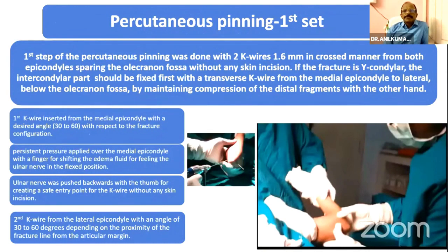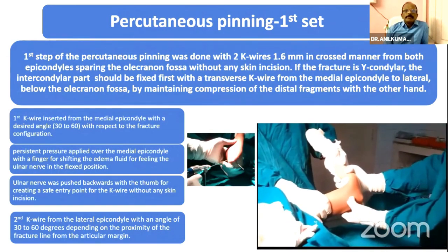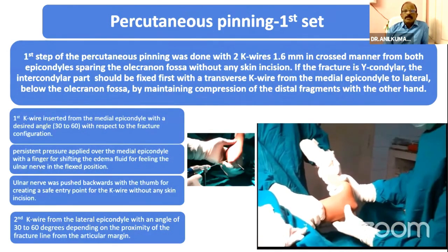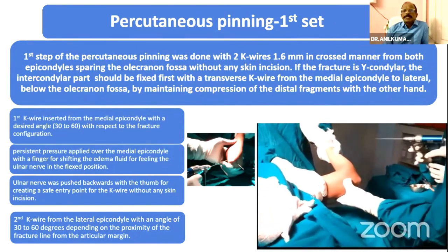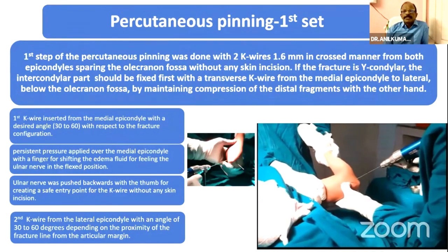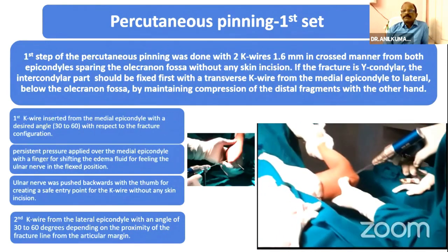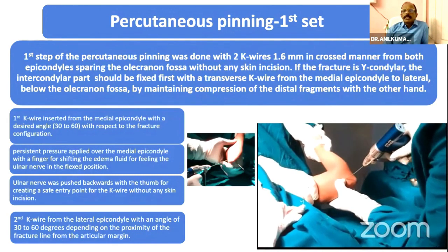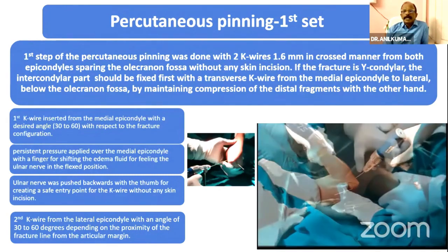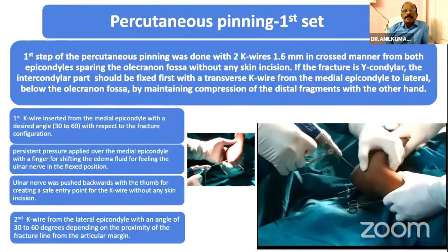The first step of the percutaneous pinning was done with two K-wires of 1.6 mm in crossed manner, first from the medial epicondyle and second from the lateral epicondyle, sparing the olecranon fossa, without any skin incision. If the fracture has a bicondylar extension, it should be fixed first with a transverse K-wire from the medial epicondyle below the olecranon fossa, maintaining the compression of the distal fragments with the hand. We can see the orientation of the wires from the figure.